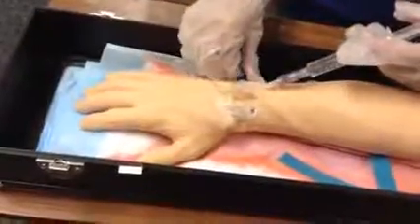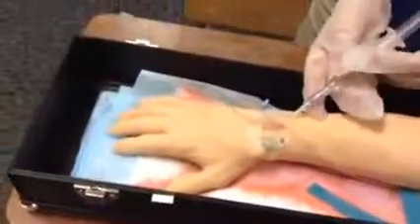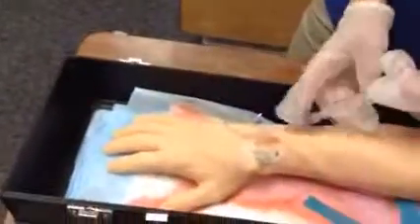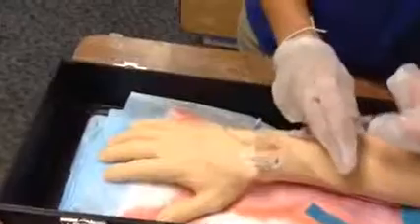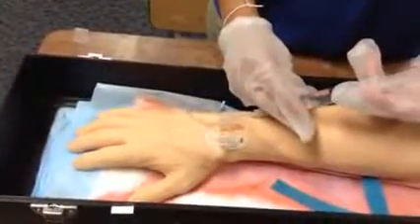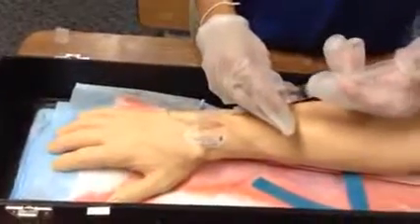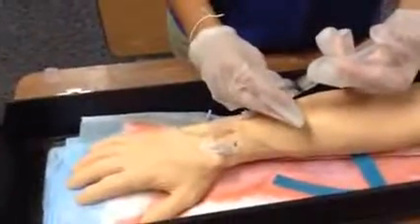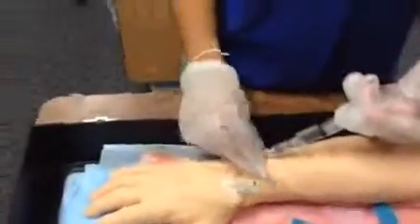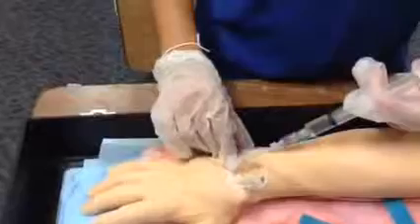Make sure that this is open. We're going to aspirate. And then we're going to gently flush 3 milliliters, again, using the push and stop method. Alright. Now we're going to clamp the IV as I withdraw the syringe.